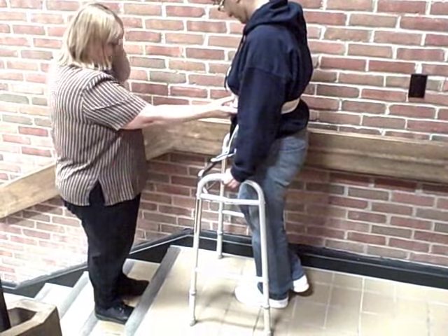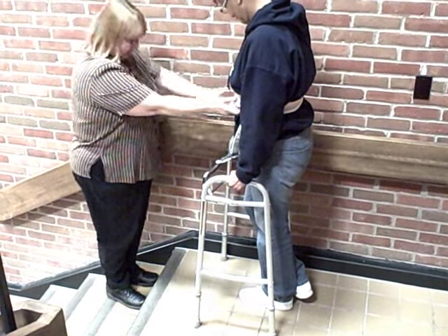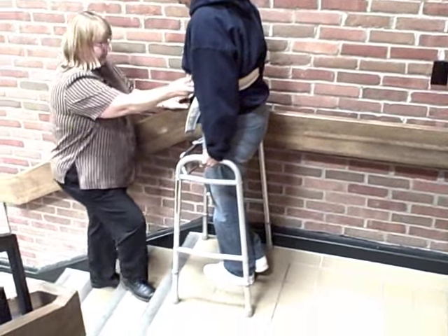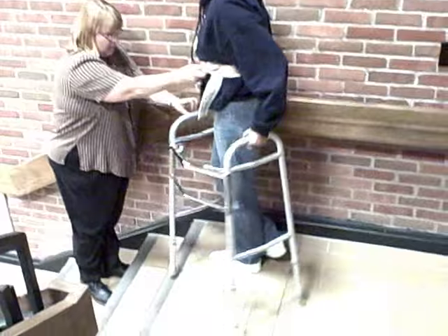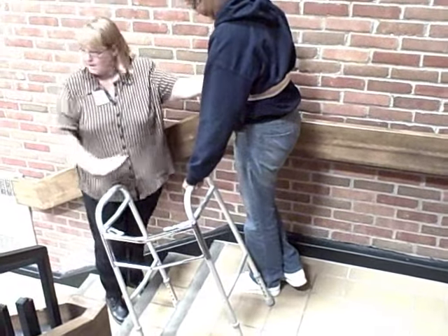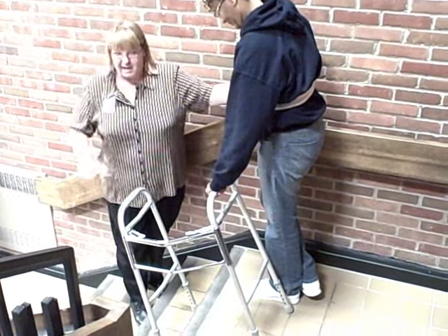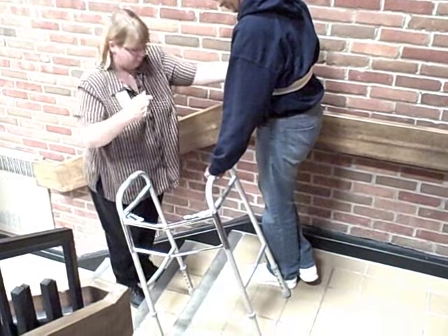We're going to use this rail. This is your bad side, so I'm going to be toward the involved side. Go ahead and step a little closer first. Hang on to the rail while you use that hand to turn the walker — put it right down. Once it's at that angled position, then you can put weight on that handle. Remember, you can't put weight on it if it's all four legs on the same level.